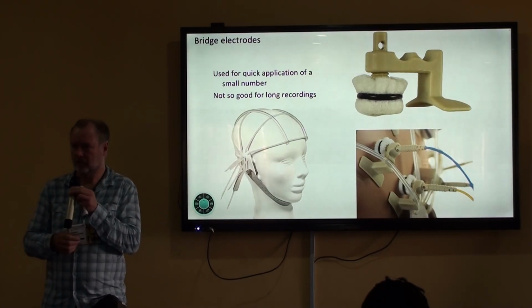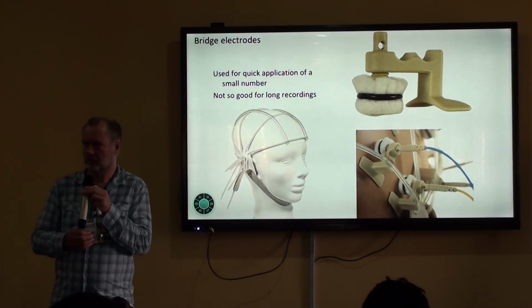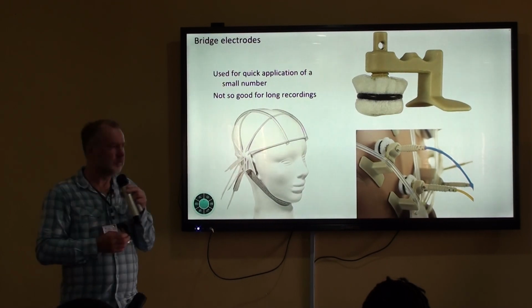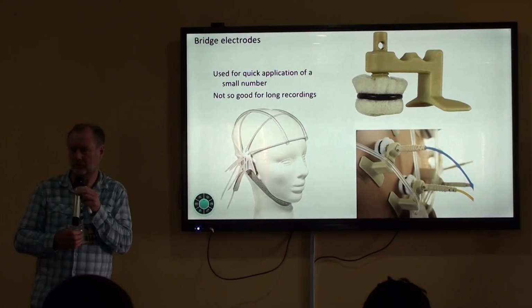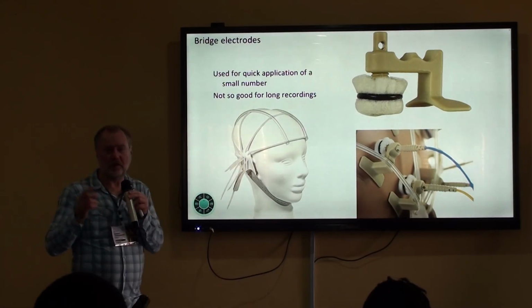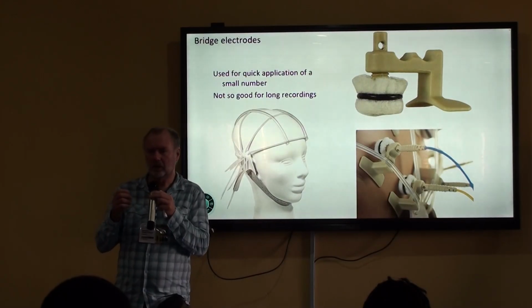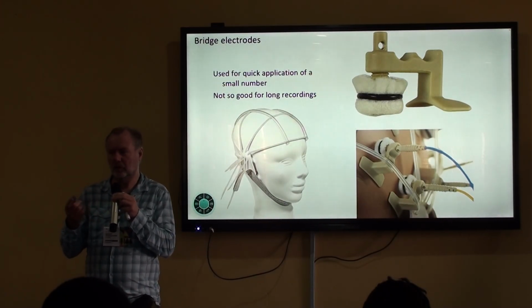Okay. Another thing is, can you use the reference electrode and ground electrode with some of these electrodes? I don't think you can apply the ground and reference electrode to all the types of electrodes. That's indeed a good point. The different EEG systems also differ in how they deal with the ground and with the reference electrodes.